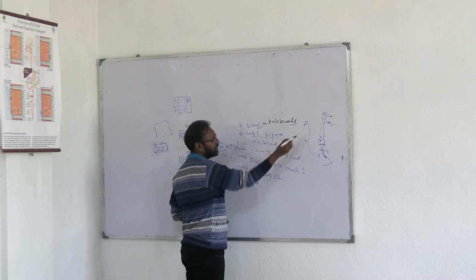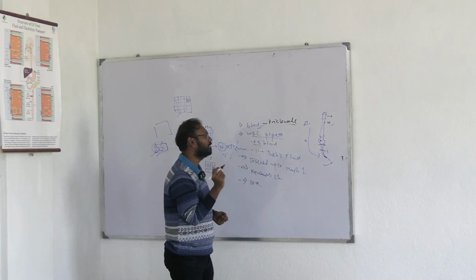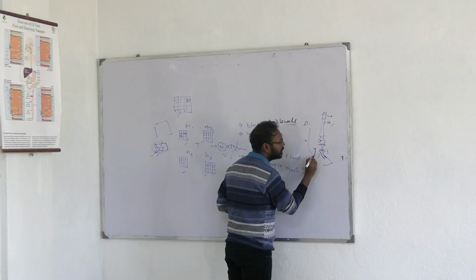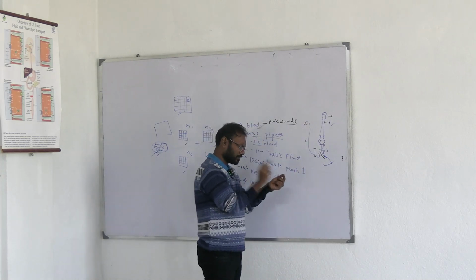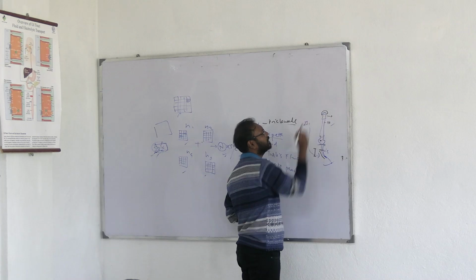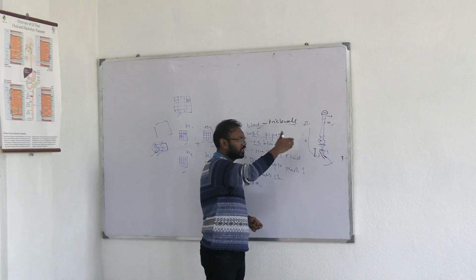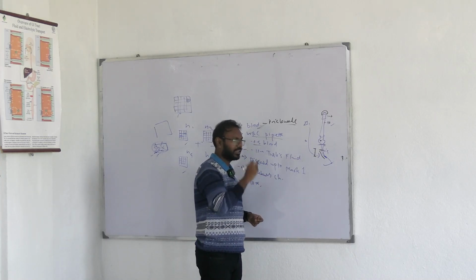In the WBC pipette, you have to take blood up to the 0.5 mark. So first you will be taking the blood. How will we take it? It will be done by capillary action. If it does not happen naturally, you have to suck a little on that place. You have to take it up to 0.5. If there are air bubbles and there is discontinuity in the fluid you have taken, you have to discard it and then take it again.